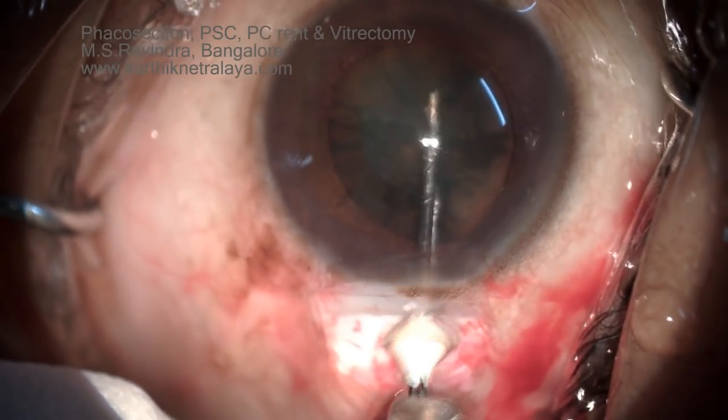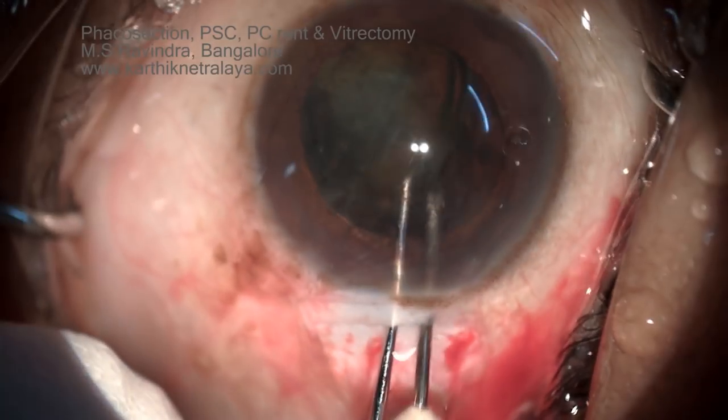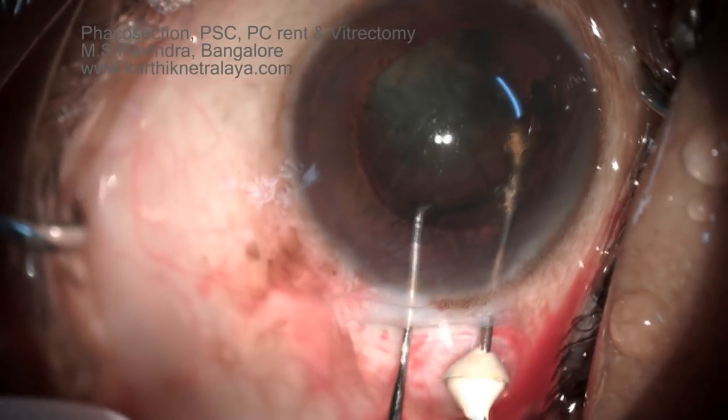The nucleus is rotated. There is no posterior capsular rent visible at this stage, even after reviewing the video at slow pace.